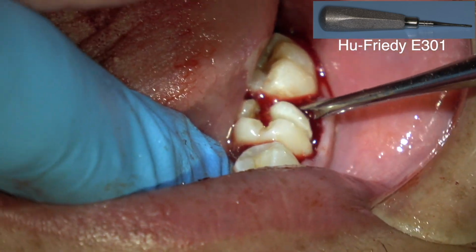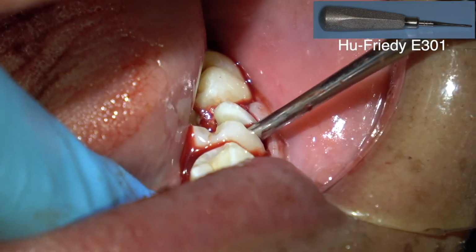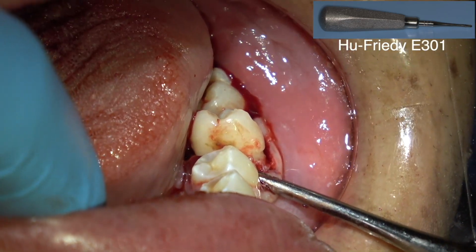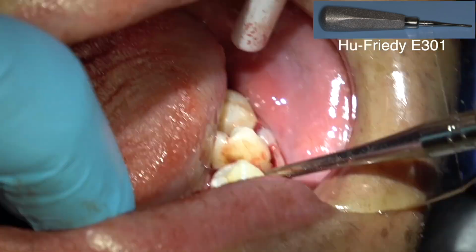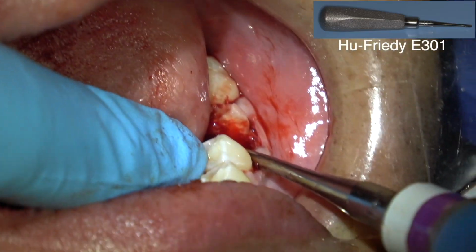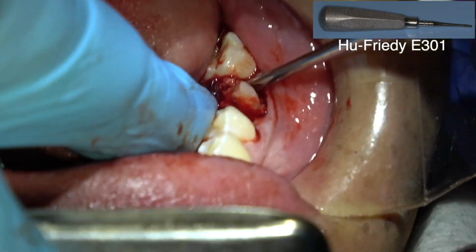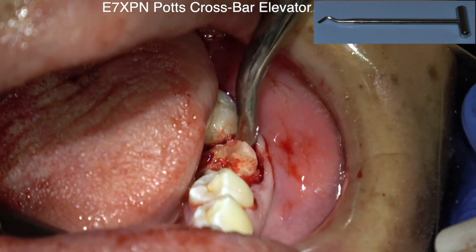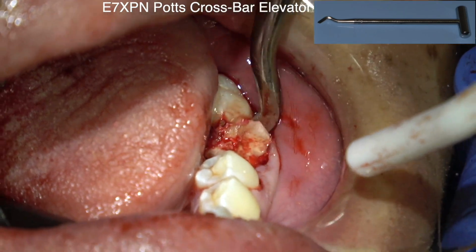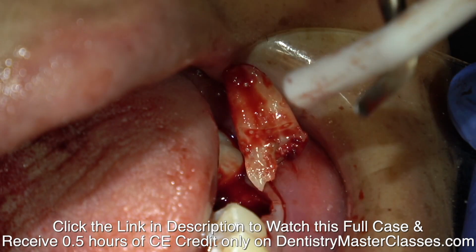When you saw me going around the facial with that round burr, I'm actually cutting into the tooth on the facial to create a little space. But I'm not removing any facial bone or any lingual bone. So I'm trying to elevate the mesial half of the tooth, just rolling that tooth with this elevator. Now I've got a mesial space to elevate the distal half of the tooth into, and you just roll it with elevators. You always need some space to elevate a tooth or a root fragment into.